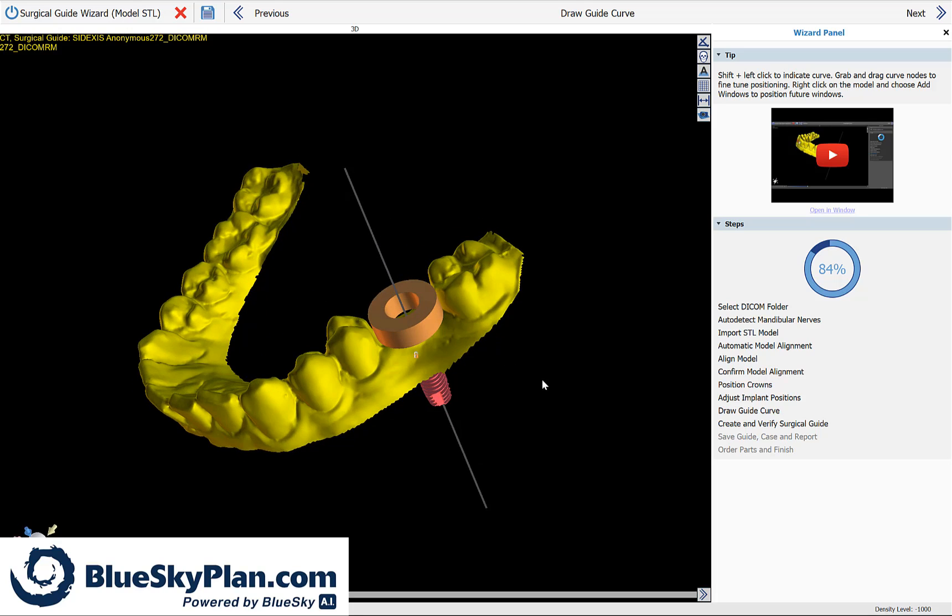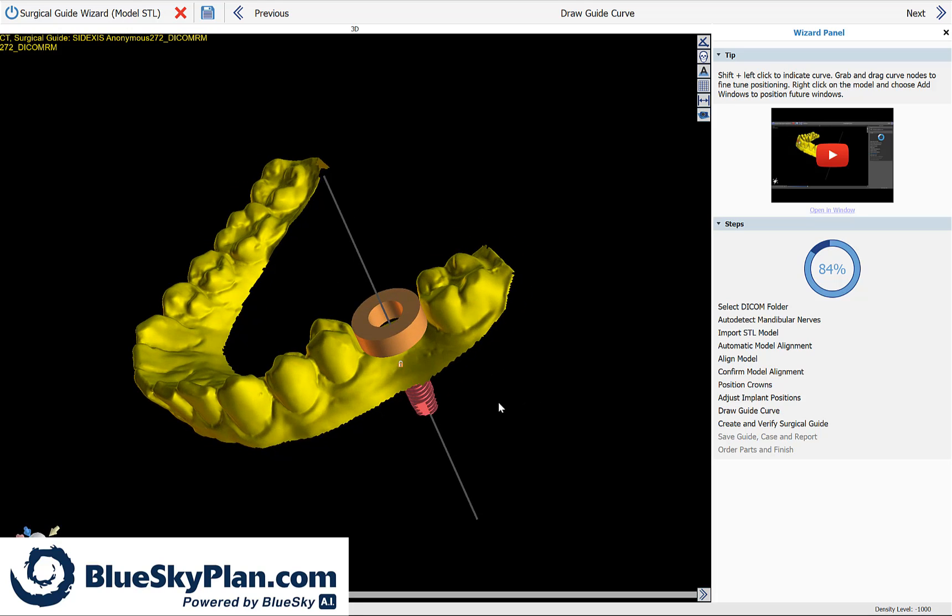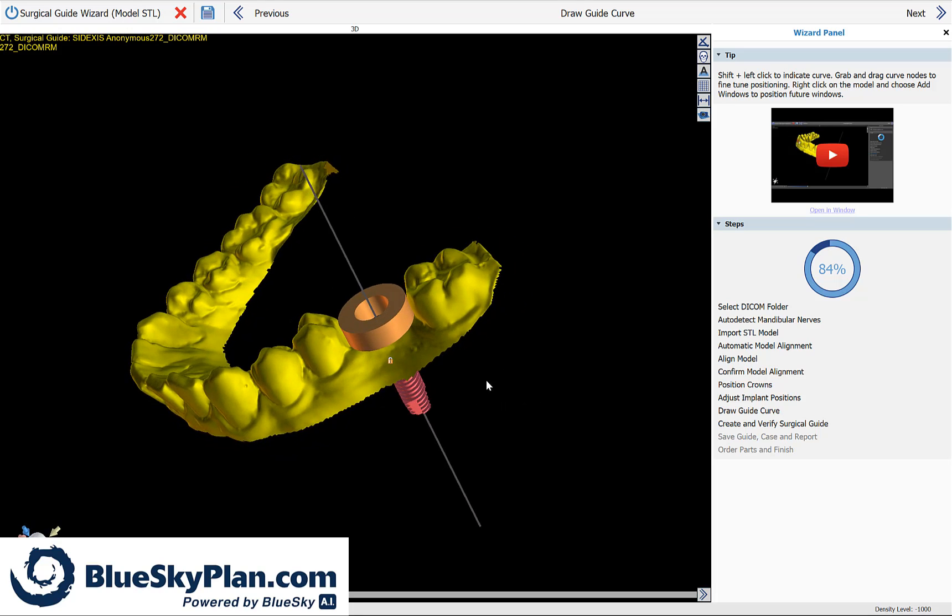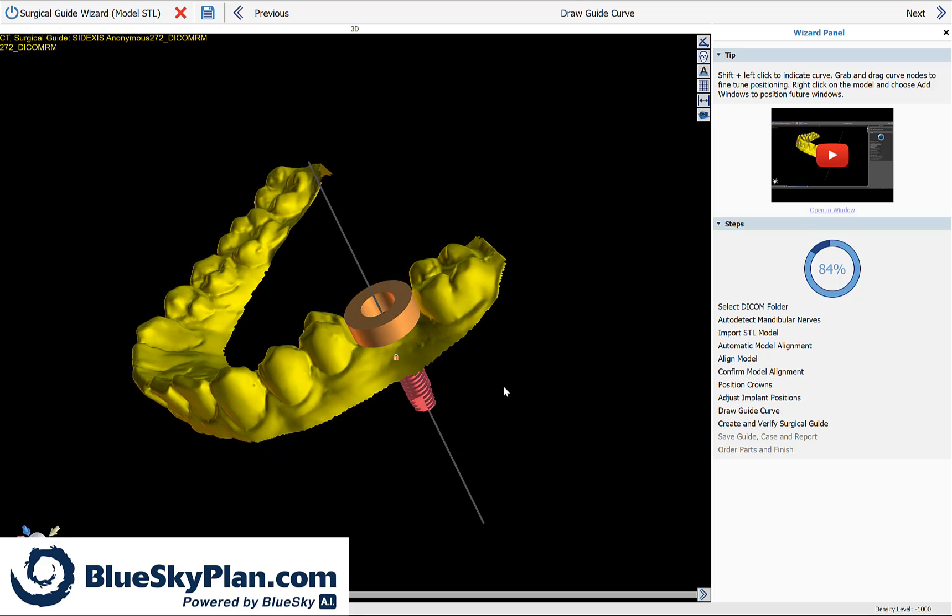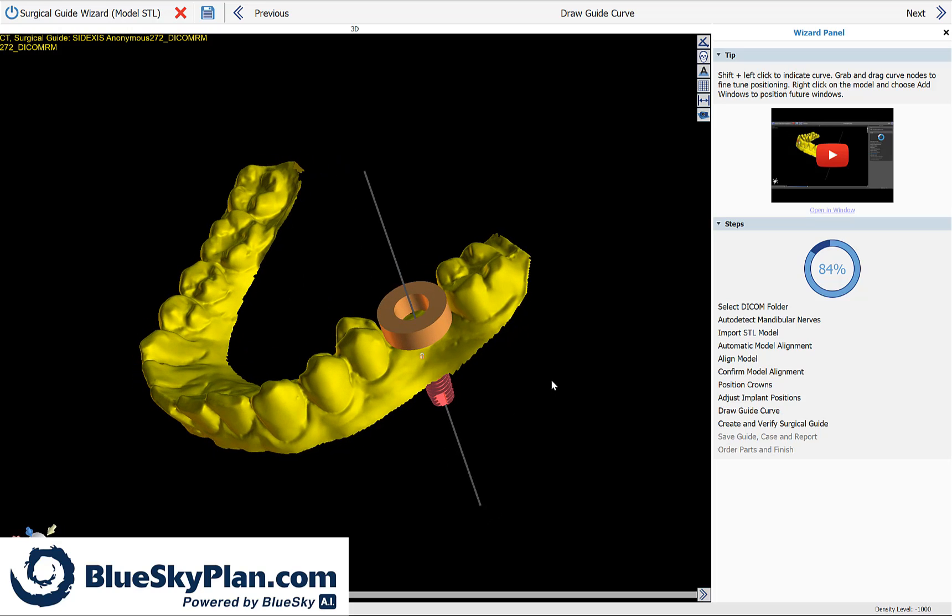Throughout Blue Sky Plan, you could rotate by using the left mouse button to grab and drag. But when it comes to marking something, hold down the shift key and click with your left mouse button.